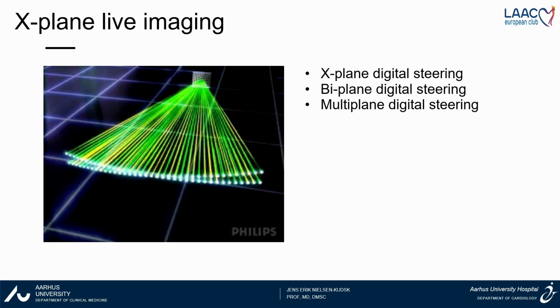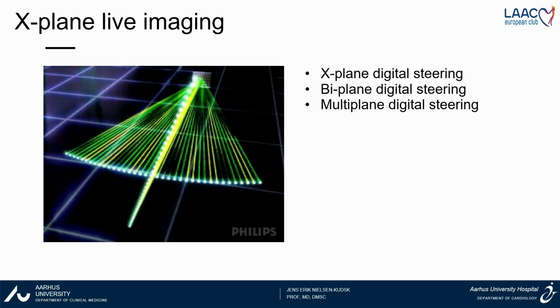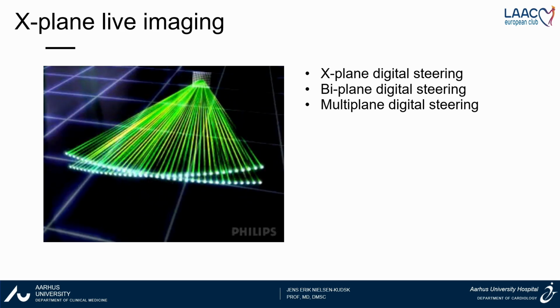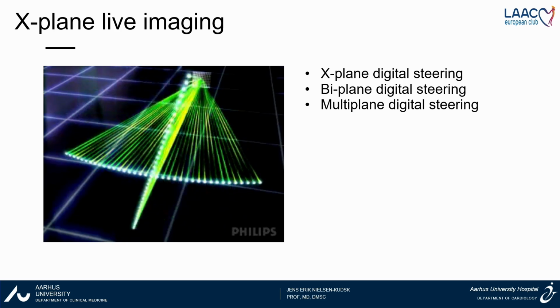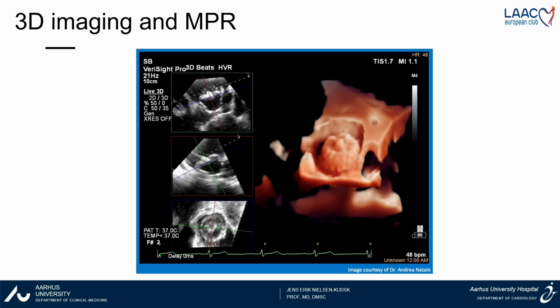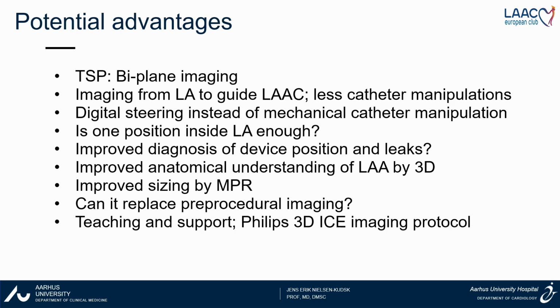And that is demonstrated here just by a digital steering that we all know from TE ultrasound probes. We can get biplane imaging and we can get multiplane imaging without maneuvering the catheter itself. And I think it's quite amazing that we now have a technology built into a 9 French catheter where we can get images like this. We can get the 3-dimensional rendering views, and we can get MPR views. I think it's fascinating technology.